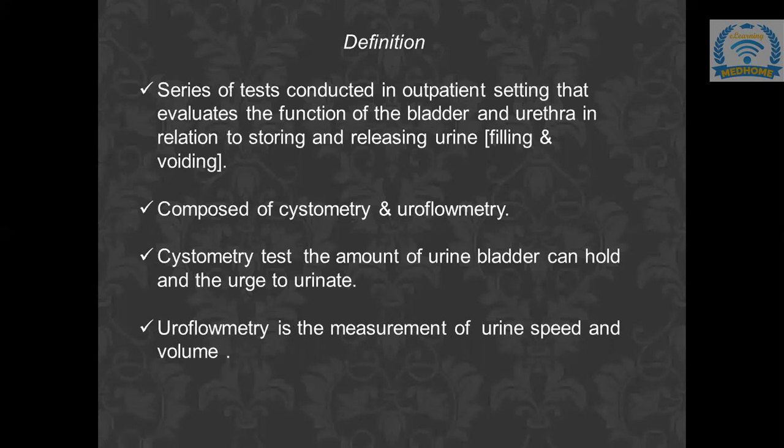So I'll just repeat what urodynamics is. It's basically a test which is done on an OPD basis that checks the function of the bladder and urethra, in relation to whether the bladder is able to store and the urethra is able to release the urine. That is, we divide the micturition cycle into the filling and the voiding phase, which we are going to discuss in the next few slides.